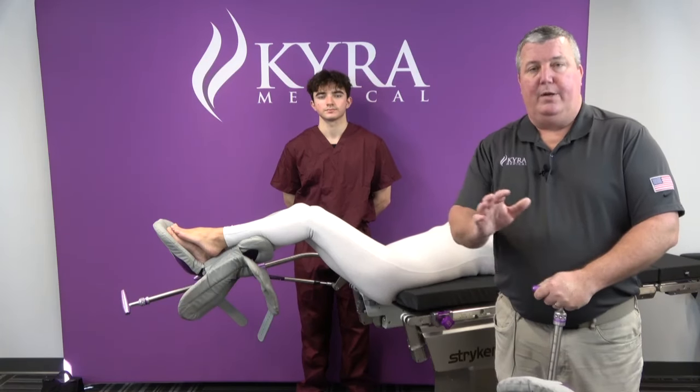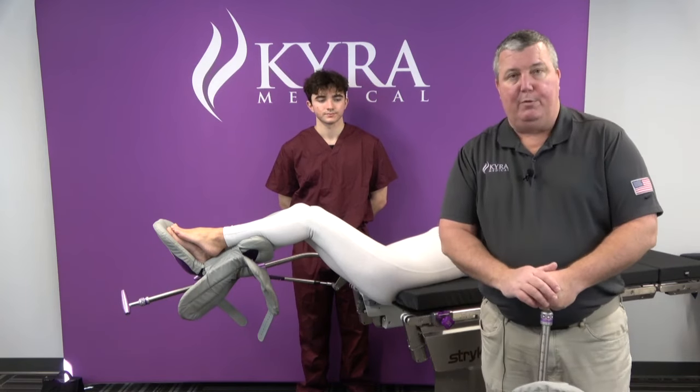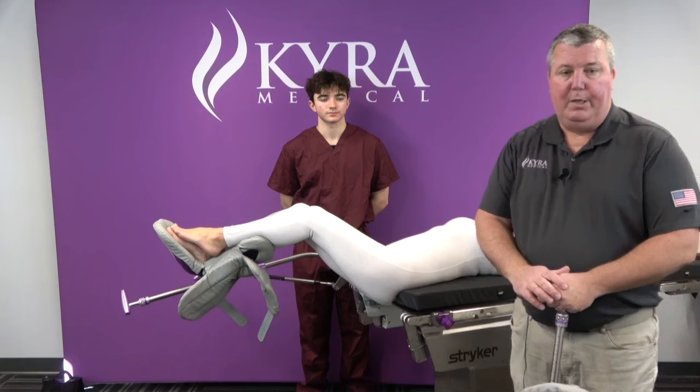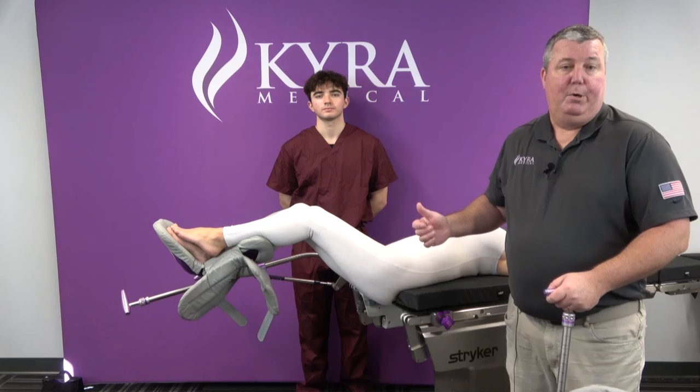Hi, I'm Mike from KYRA Medical, and today we'd like to discuss how to position a patient in lithotomy stirrups. We have our KYRA Comfort 350s, our patient, and our assistant. This is going to be a two-person job, because we want to be able to move the legs into the stirrups and do it as a mirror image.